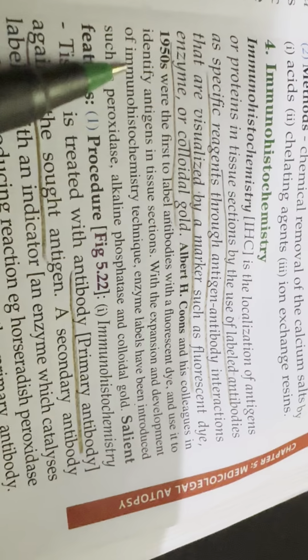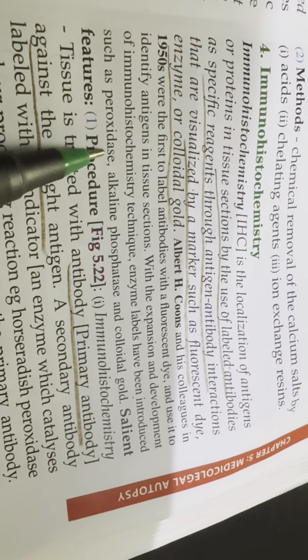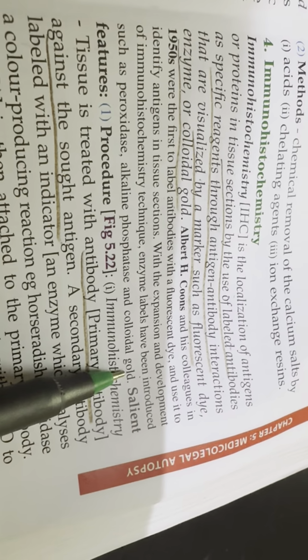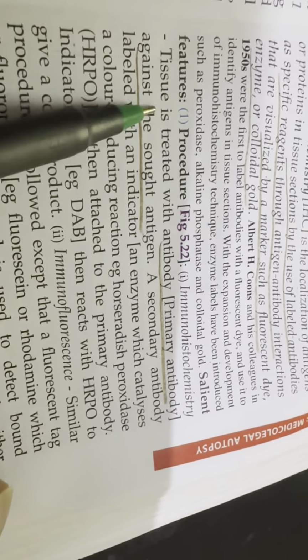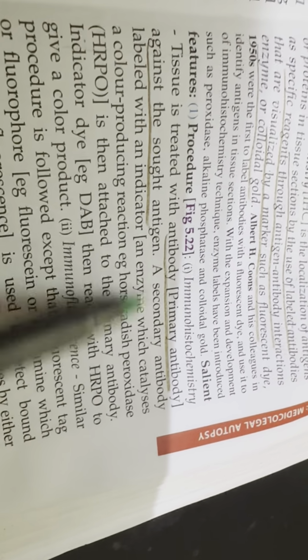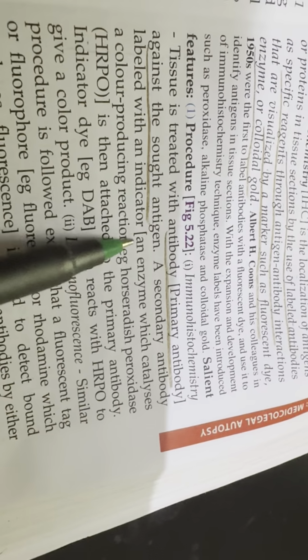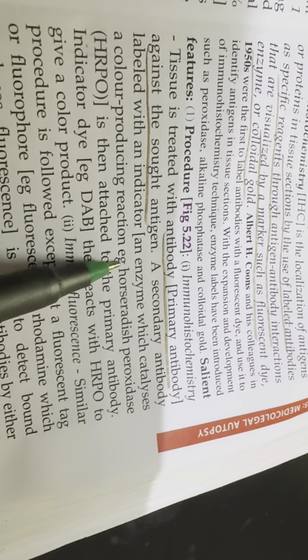With the expansion and development of immunohistochemistry technique, enzyme labels have been introduced, such as peroxidase, alkaline phosphatase, and colloidal gold. Procedure: in immunohistochemistry, tissue is treated with a primary antibody against the sought antigen, and a secondary antibody labeled with an indicator, an enzyme which catalyzes a color producing reaction.